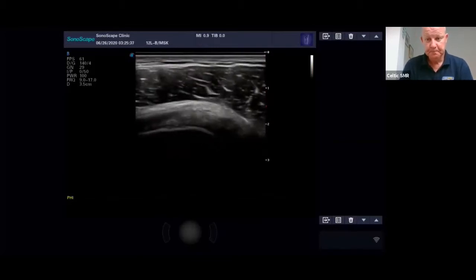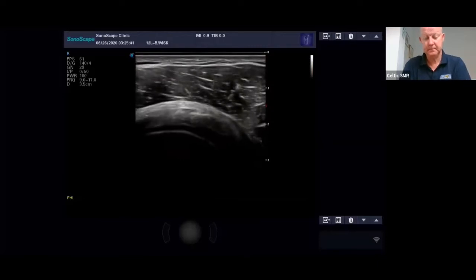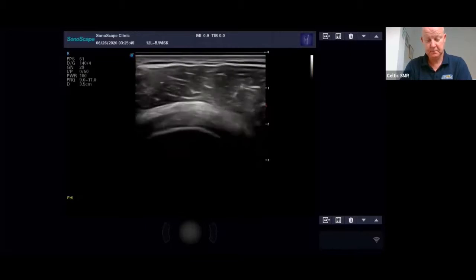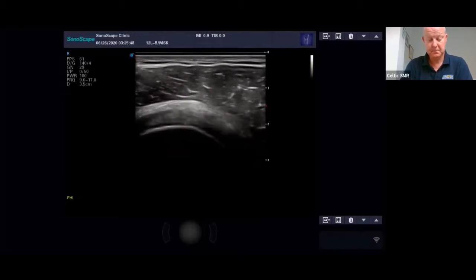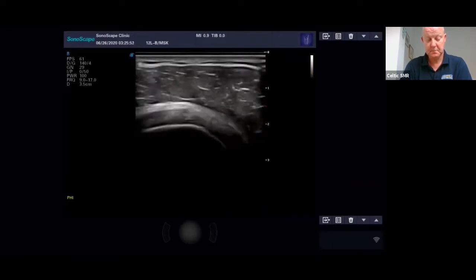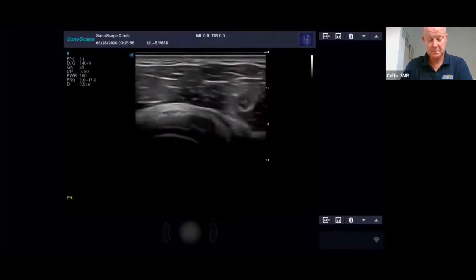I think Abid mentioned last week also that a light pressure is always good in ultrasound. So keep your pressure light, don't press too hard, and then that will allow you to see things that you'd probably be otherwise compressing, like the bursa, for instance.